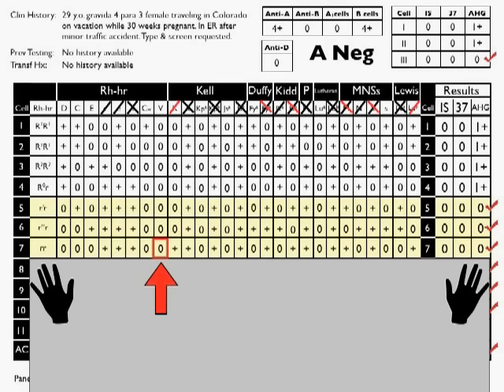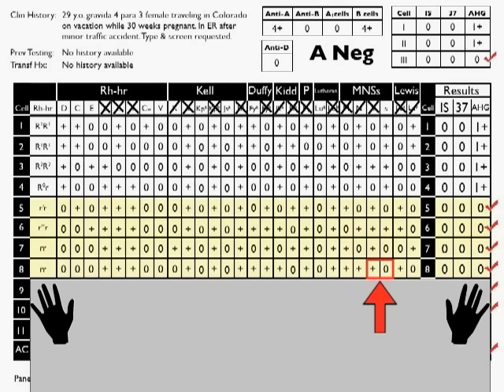Okay, back to RH, nothing for V, nothing for CW, already ruled out F, double dose rule out for little e, single slash, double dose rule out for little c, single slash, and again, nothing for big D. Cruising on, cell 8. Back to the Lewis system, already ruled out Lewis A, already ruled out big S, single dose expressions, no rule outs, onto Lutheran, already ruled out Lutheran B, already ruled out P. Here's another double dose rule out for JKA, so put another single slash. Single dose expression of both Duffy A and Duffy B, nothing to do. We've already done JSB, already done KPB, already done little k, nothing for V, nothing for CW, already ruled out F, already ruled out little e, already ruled out little c, and nothing more for big D.